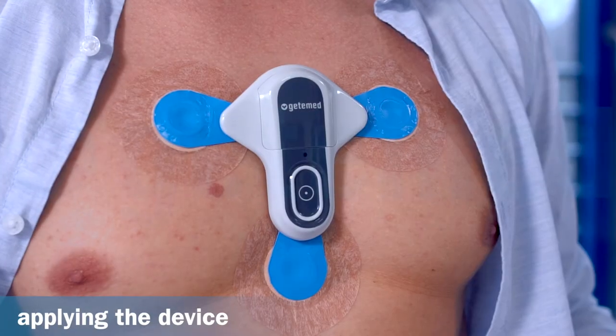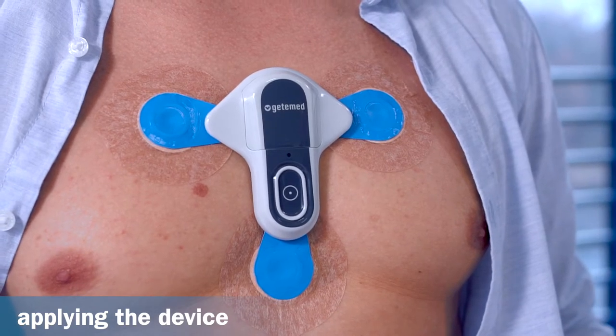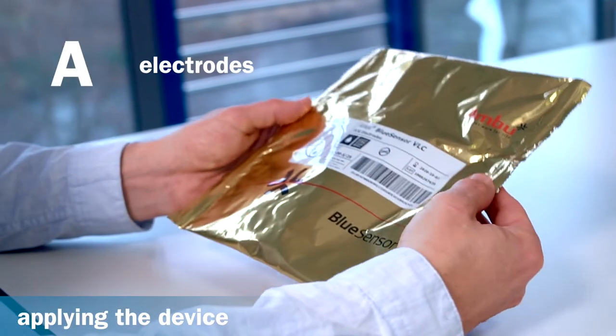Before you get the recorder, the medical staff will configure it to suit your situation. To ensure optimal recording and ECG quality, it is necessary to use the correct electrodes.